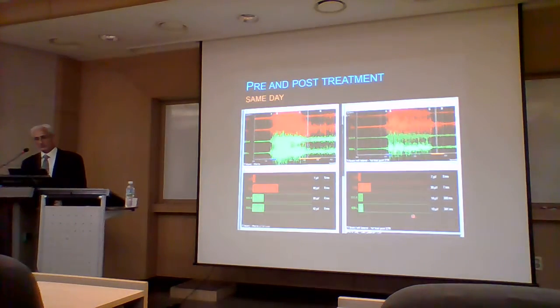And then the change in the patient's physiology. Very high muscle firing, C to D far apart. Very low muscle firing, C to D close together. 이기가 시작될 때부터 이게 완료될 때까지 시간도 굉장히 길고 그 기간 동안에 머슬 액티비티도 굉장히 많이 남아있는 것을 볼 수가 있었는데 부치부치 컨택되는 건 많이 없어졌고 나니까는 시간도 줄고 액티비티도 많이 발생 안 하는 것을 볼 수가 있죠.